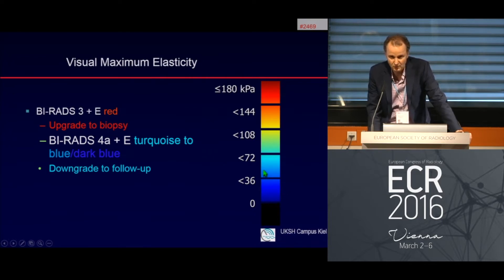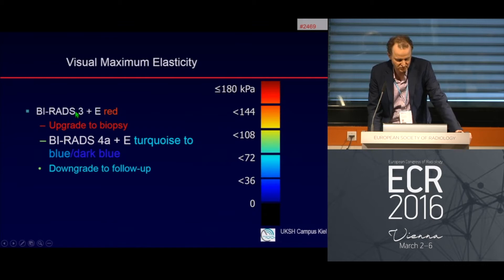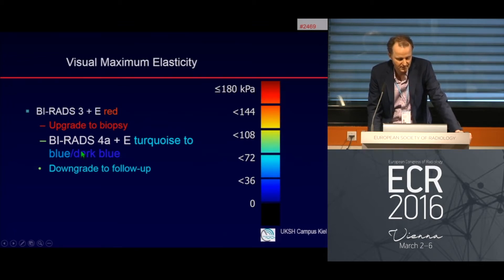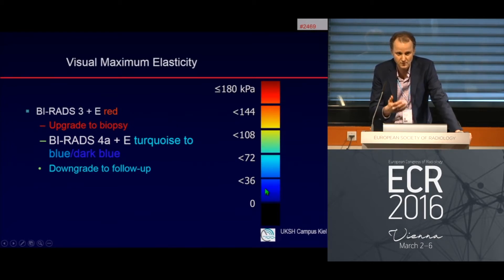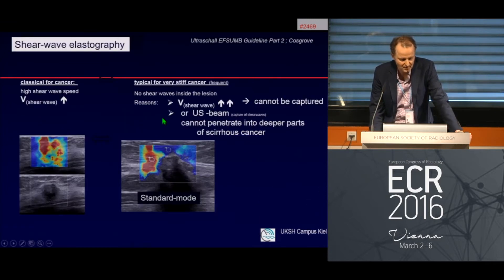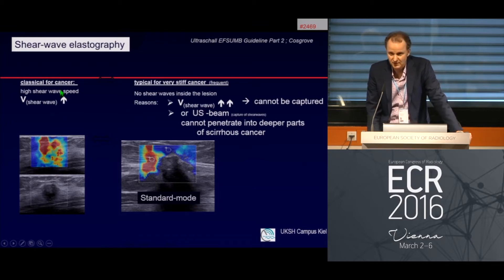Looking at BI-RADS 3 findings: if we see a very stiff, very heterogeneous area in B-mode, we consider upgrading to biopsy. For BI-RADS 4a findings, if the color is blue or dark blue, we may downgrade to normal follow-up and prevent the patient from an intervention.